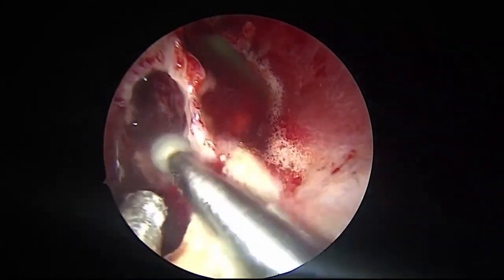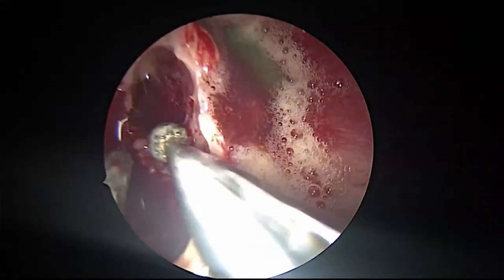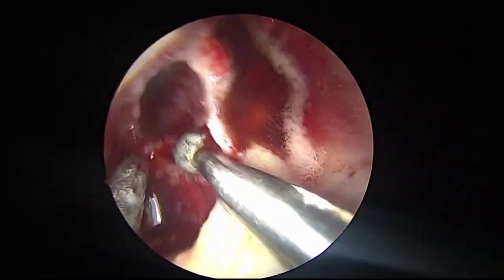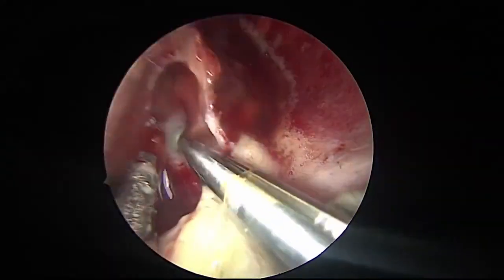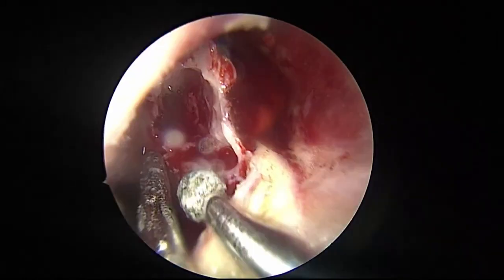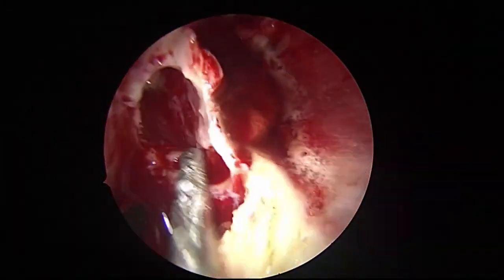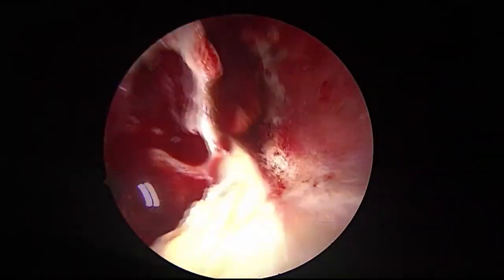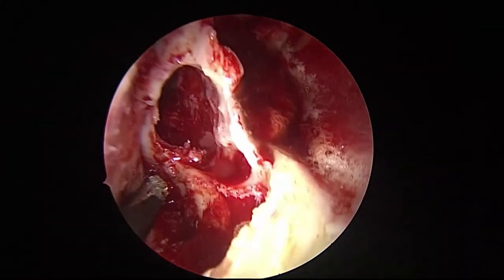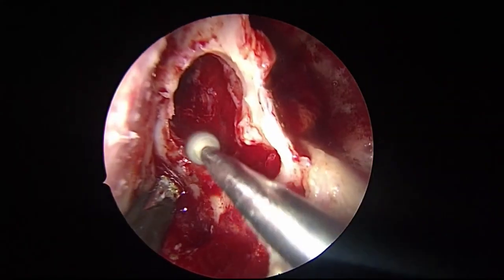Thinning out this bridge of bone so that I can punch it out with a Luc later. See, more and more bone I'll remove.